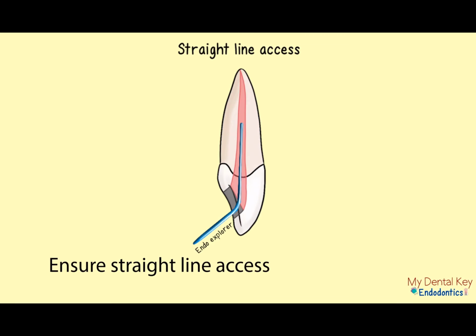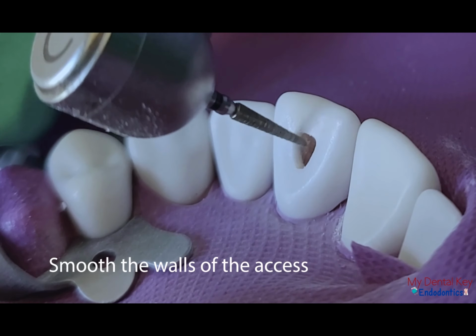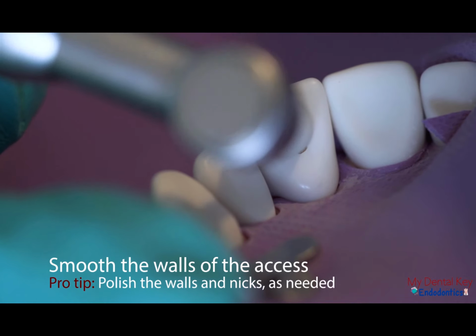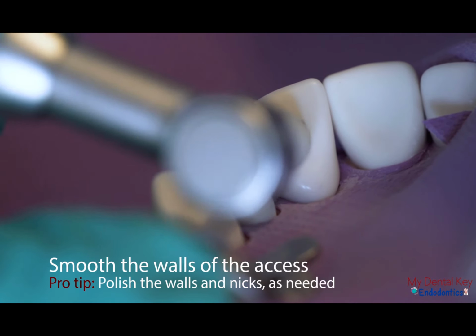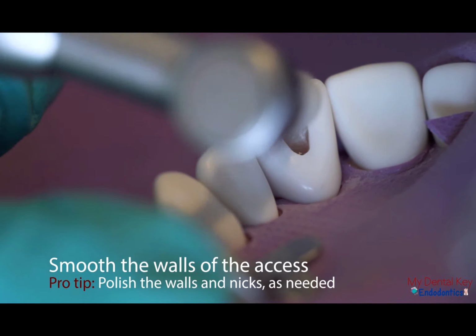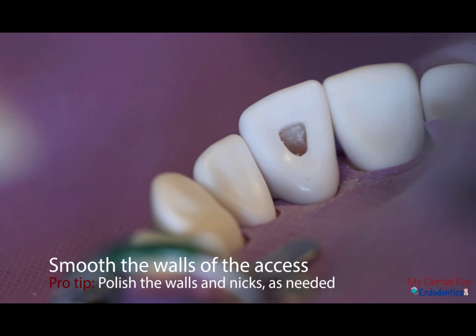Next, ensure that there is straight line access to the orifice opening using the Endo Explorer. Finally, smooth the walls of the access chamber using a high-speed or low-speed handpiece. If you nicked the tooth, don't panic. Use the rubber tip to polish the nicked spot. Besides, for the CDCa exam, small ledges and nicks are okay. In order to fail, the gouges must be excessive or compromise the integrity of the tooth.